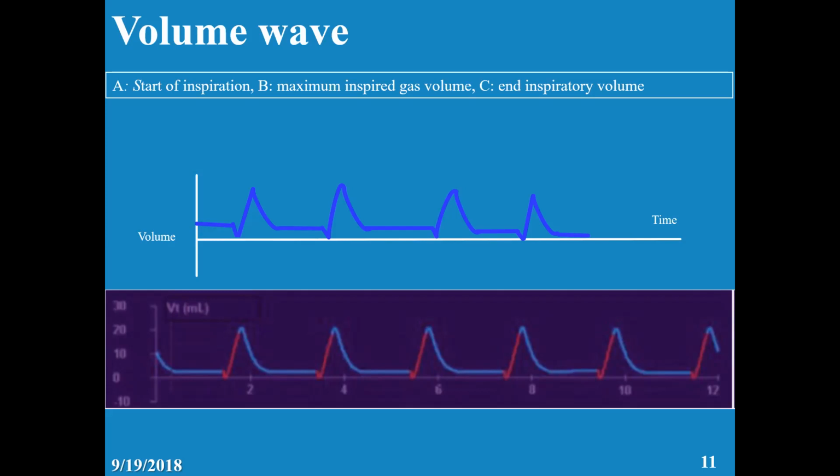AC mode, doctor. Which mode has assisted breath? No contribution, no opinion? Just say something. AC mode has assisted, yes. What else? PSV mode has assisted, right? Yes. So this is either AC or PSV.